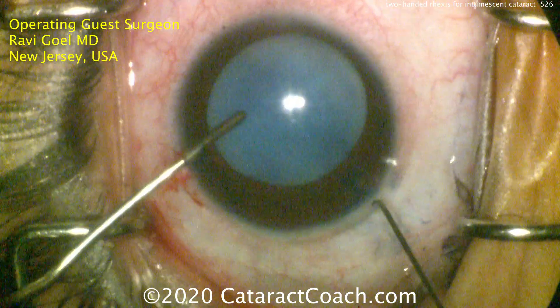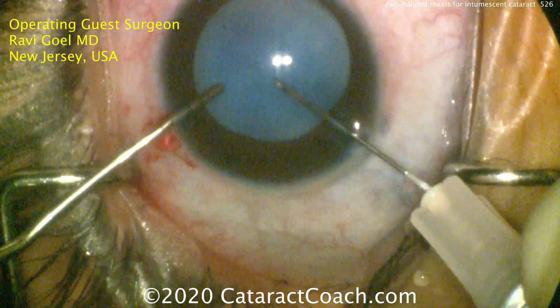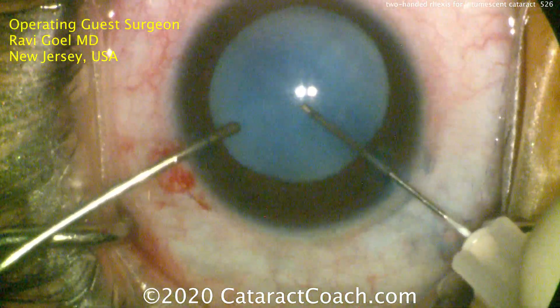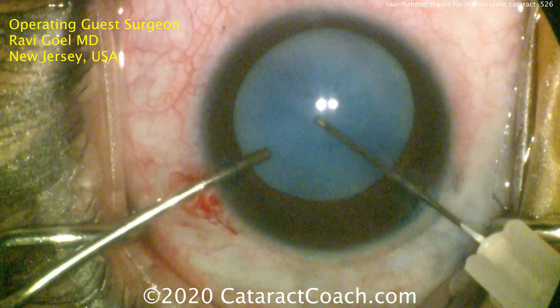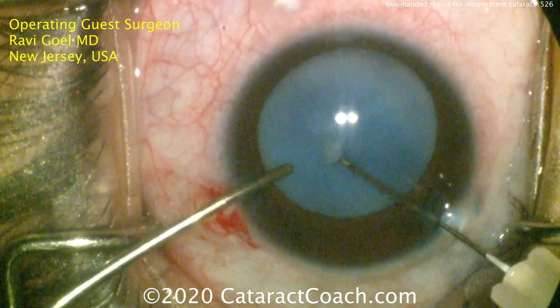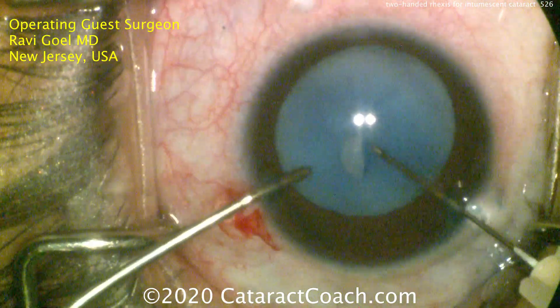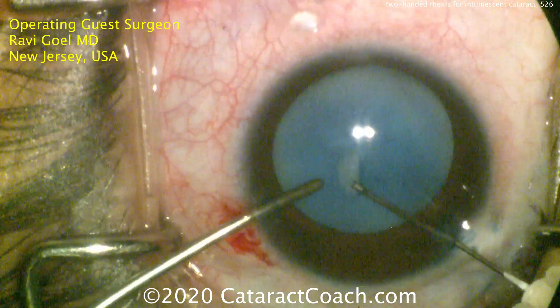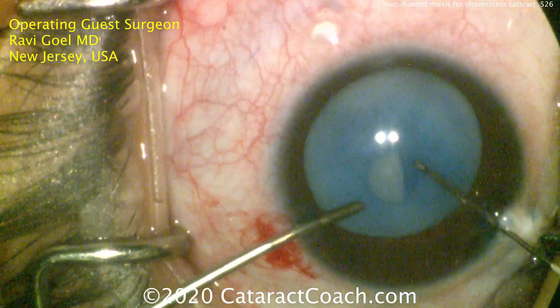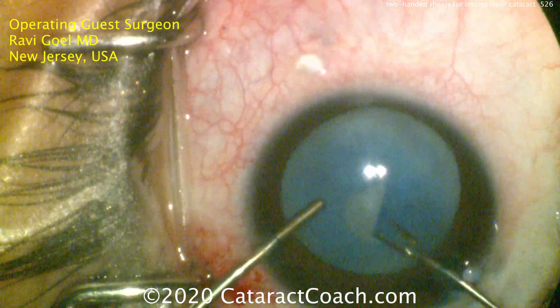Intumescent white cataract on a young patient prior to a vitrectomy. The left hand is stabilizing the eye. You can also use a viscoelastic cannula in that left hand to keep the anterior chamber pressurized. The right hand now has a cystotome. Notice that there are just two paracenteses incisions — there's no main incision. That's important because we have to keep the pressure in the anterior chamber high — it has to be higher than the intralenticular pressure. That's going to prevent egress of that intumescent fluid from the lens capsule, and help prevent the Argentinian flag sign. That's why it's just two paracenteses and highly pressurized.